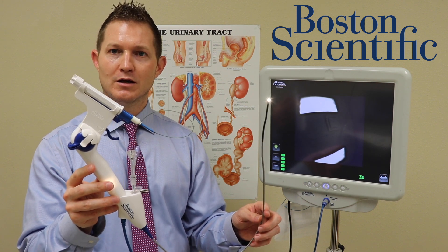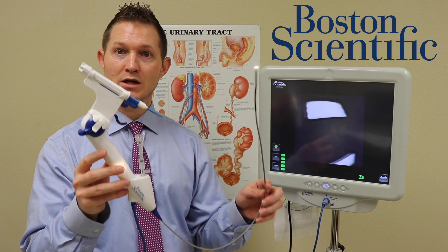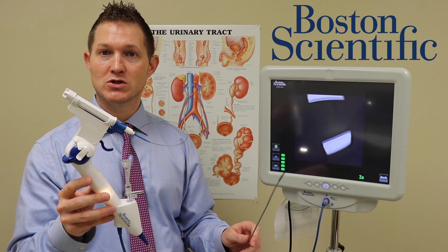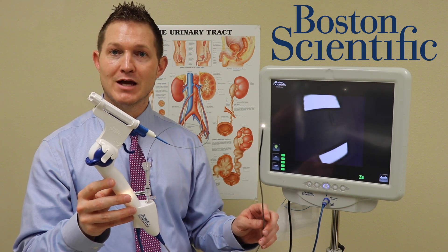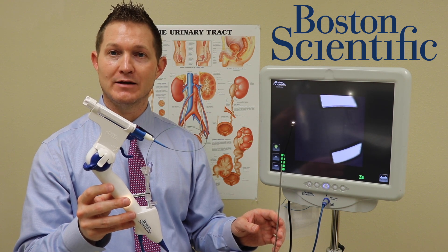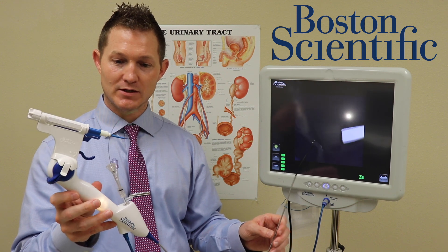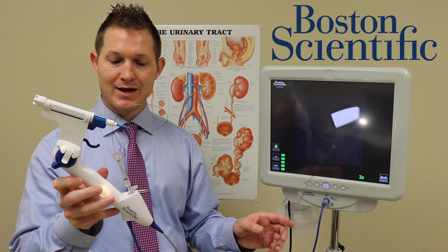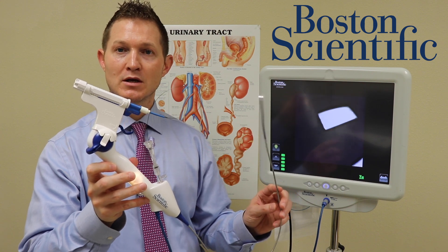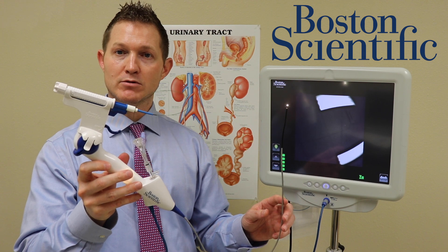In infection prevention, this is an evolution that allows us to use a disposable scope that provides great image definition and allows us to navigate through your surgery very safely and efficiently. This device has been invented within the last few years and replaces a typically reusable setup for a ureteroscope.